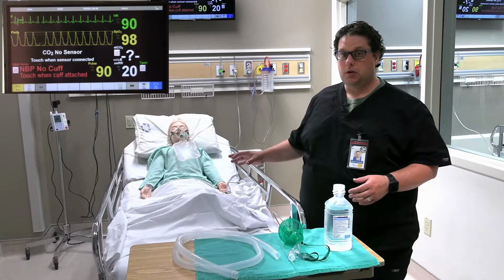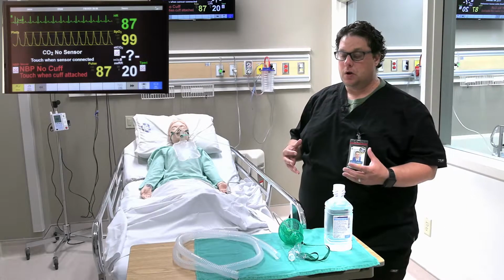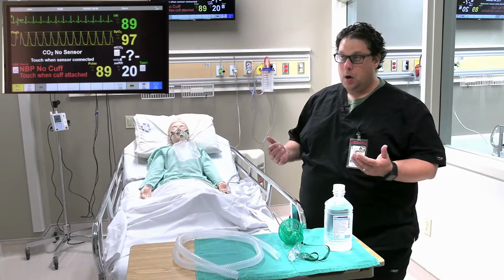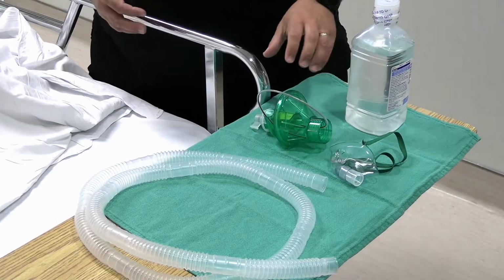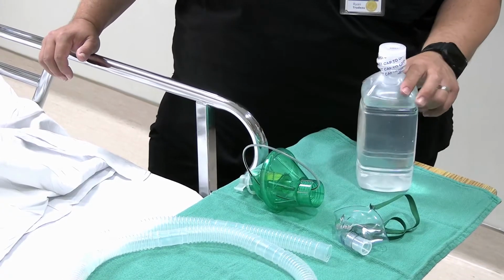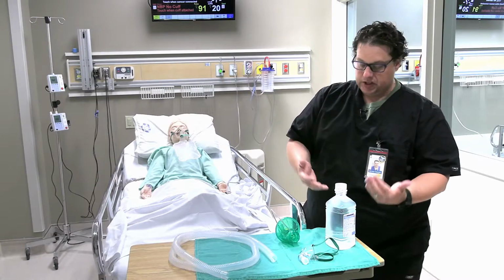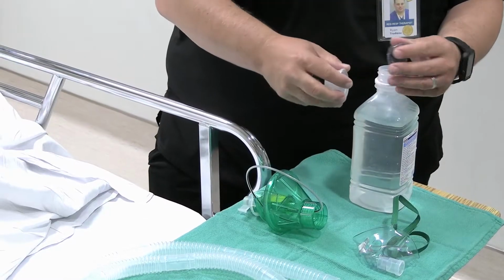Your patient is currently stable on the non-rebreather mask, and you want to begin to start weaning your FiO2, but also you want to consider providing some humidity, because long-term use of the non-rebreather can be quite uncomfortable for the patient. So what I'm going to demonstrate to you is the setup of the HiOx large volume nebulizer here. So what you're going to need is your HiOx nebulizer, a bottle of sterile or distilled water, your aerosol mask, and your corrugated tubing. Now, what we recommend is you can just use the bottle as is. We'll just remove the lid, just like that.